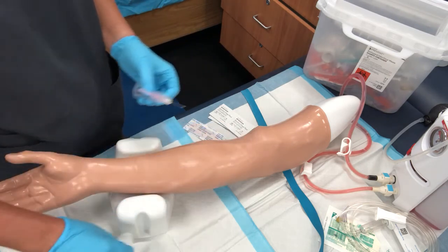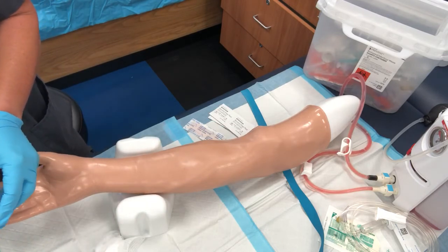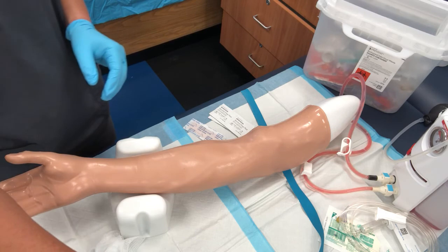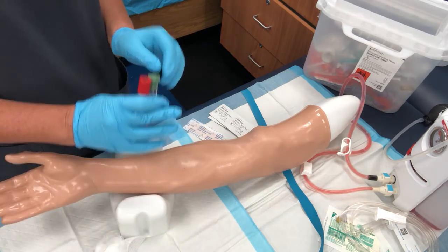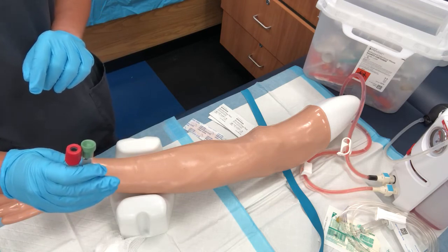All of my specimens are going to immediately be marked. They're gonna have the patient's name, date of birth, time of collection, and then all of your vacutainers that you have are gonna go to the lab so that all of your laboratory values can be run.